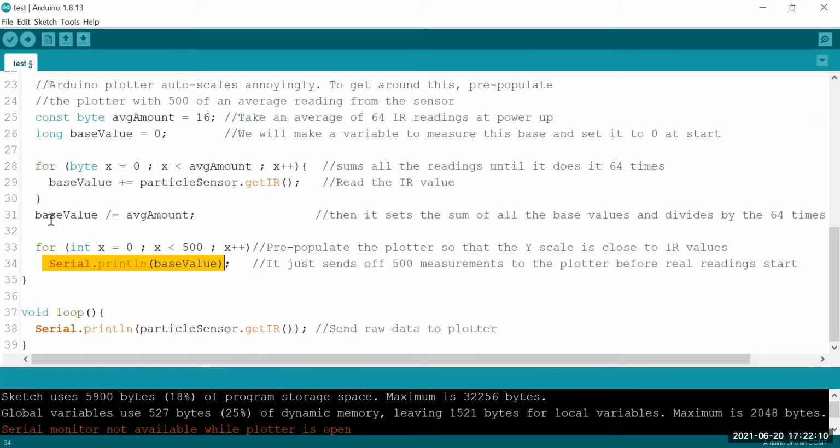So it's going to keep printing the base value, where the base value is going to be averaging. I'm going to pick an average of 16 times just to make this code populate a little faster. So it's going to take 16 measurements, average it, and then send it to the serial monitor. It's going to repeat that 500 times, and that's just going to pre-populate the graph. That's so the serial monitor starts at the correct zone, zoomed in on the y-axis. Then the whole code that you need is just printing the particle sensor's data value.